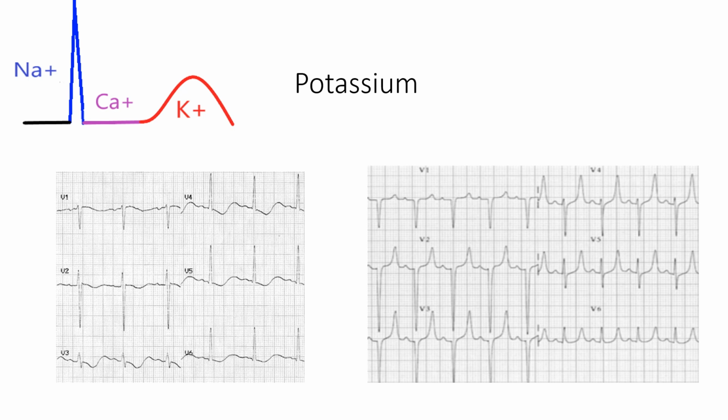And in the ED, obviously, or in hospital, or in the back of an ambulance, if you have point of care lab testing, obviously the easiest way is to not use the ECG. That's not the most sensitive test to determine a patient's potassium level. That's just to measure their serum potassium level. So if you're getting weird T-wave changes and your patient's potassium's 8, well, hey, you figured out your problem.